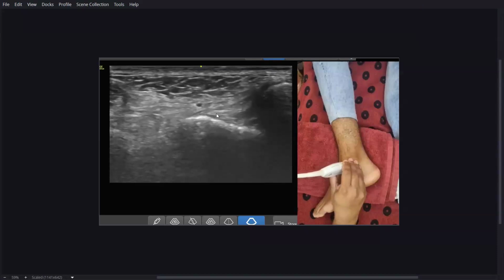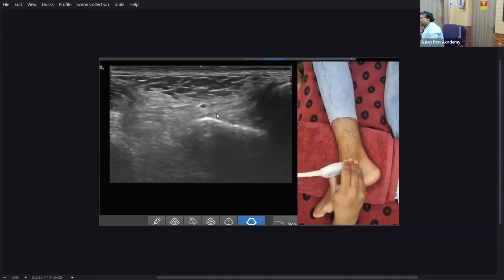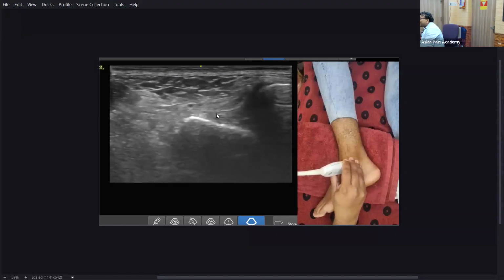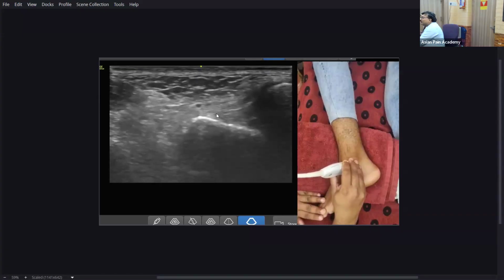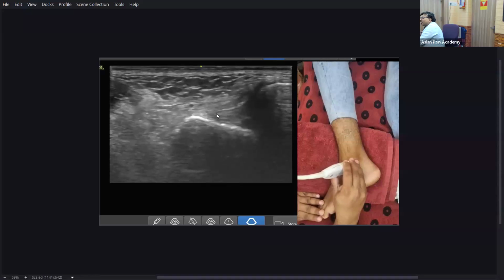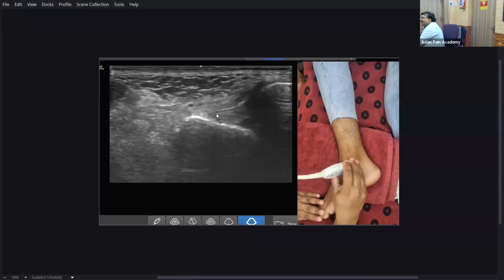Yes, gain. It's seen beautifully. Now look for a little up and down. So in the presence of any injury or nearby edema, because remember when we get an ankle injury, in most of the patients, especially if it is an inversion injury, what happens? Most commonly this ligament is torn. Even one of my ATFLs is torn. It is not a total tear, but a partial tear, that injury I got long back. But remember, sometimes it can be painful for a very long duration.